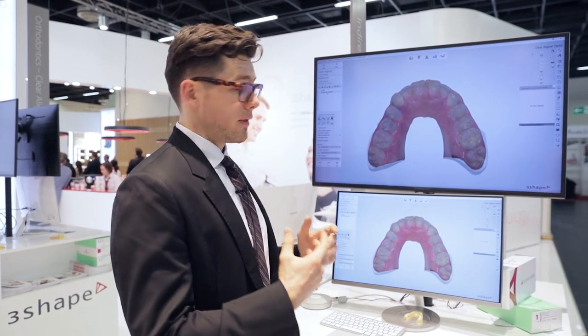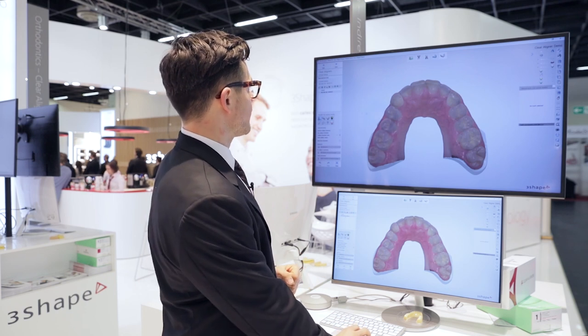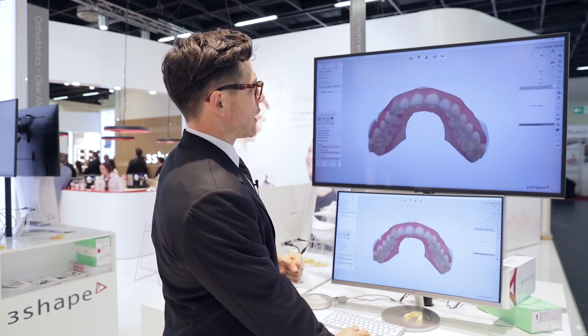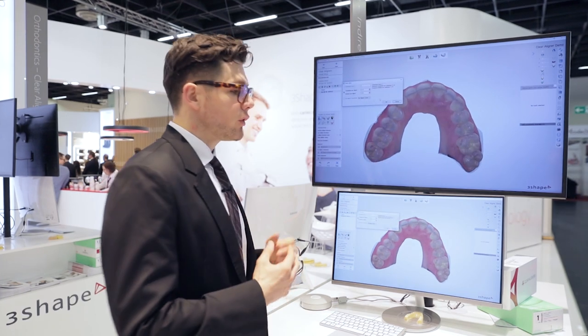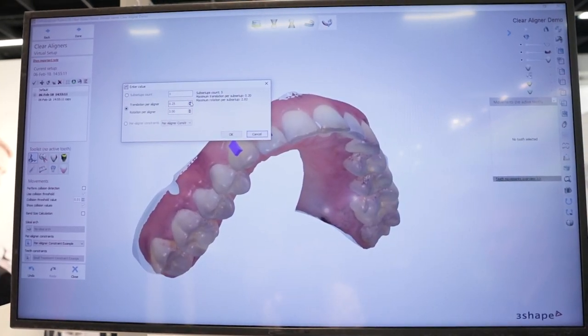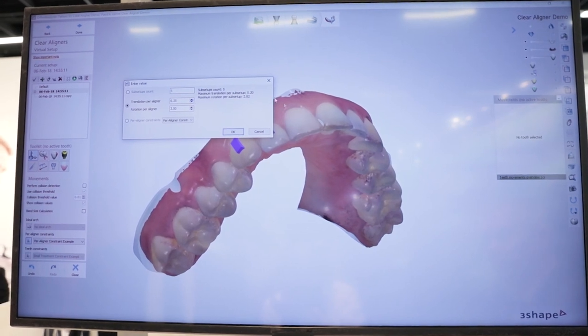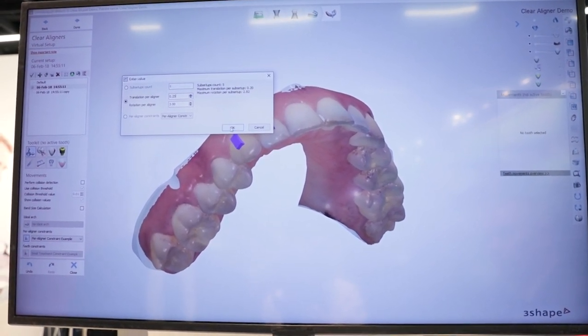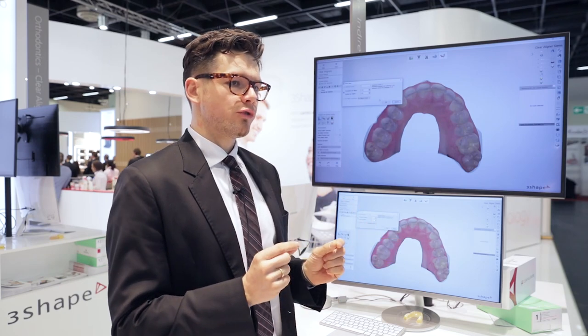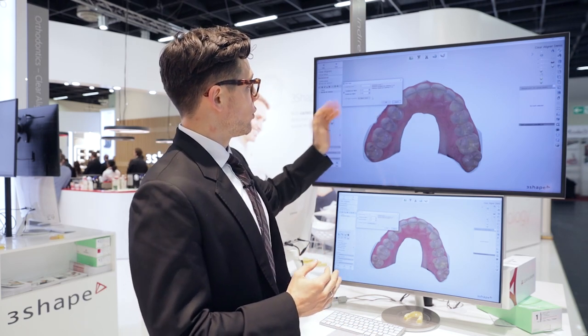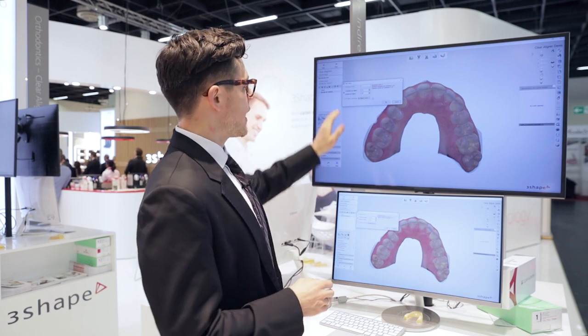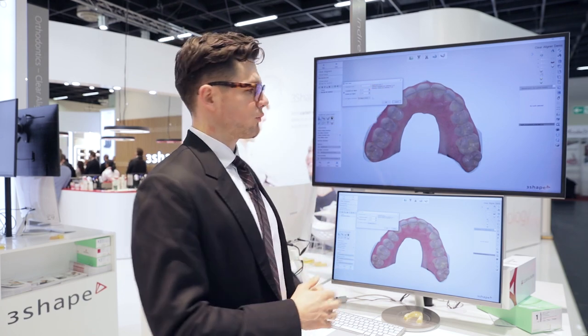I've moved the teeth into a nice position. The first feature I'd like to show you is how to subdivide. It used to be that you as the user would figure out how many stages you want the setup to be. Now you can put in your own constraints and the system will automatically calculate how many aligners that translates into based on how much movement you want to do per stage. The system already calculated that for me — I'm going with a quarter of a millimeter and three degrees rotation per stage, and it calculated seven sub-setups for me.